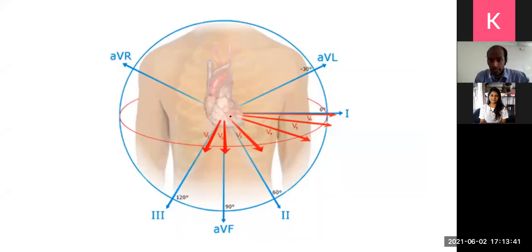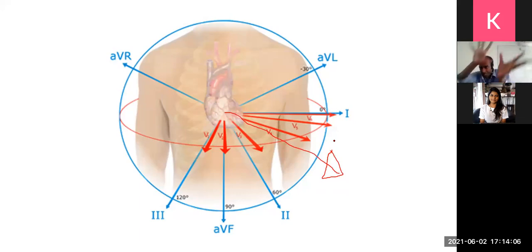Now usually the cardiac axis is like this. That is normal, somewhere there. The cardiac axis refers to a summation of the electrical activity. It is a summation of the electrical activity. It gives you the general direction the current is going. The whole current goes like this and all over the place.